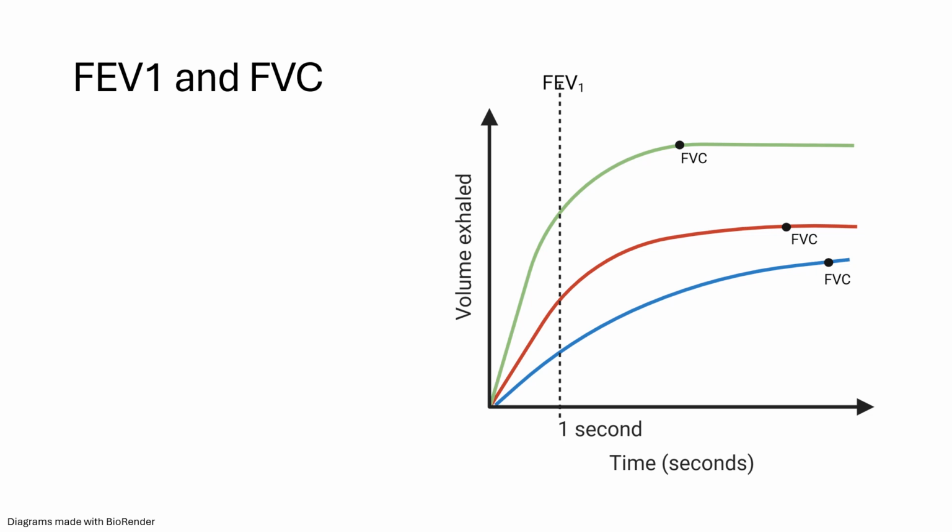Okay, so if I just measure your FEV1 and my FEV1 and our case study patient's FEV1s, I'm good, right? I can compare them to each other. No. It's like getting an A in my class and getting an A in my colleague Suzanne Keller's class, who was known as Killer Keller and definitely taught in a much more difficult manner than I taught. So an A in our classes are not really equivalent. If you want to use FEV1, you have to express it as a proportion, as a percentage.